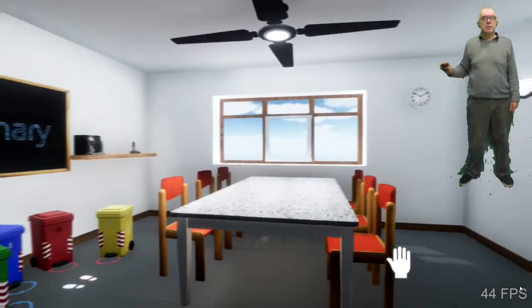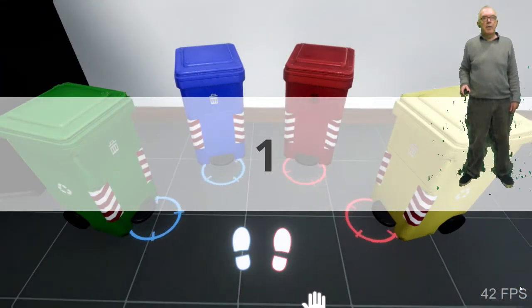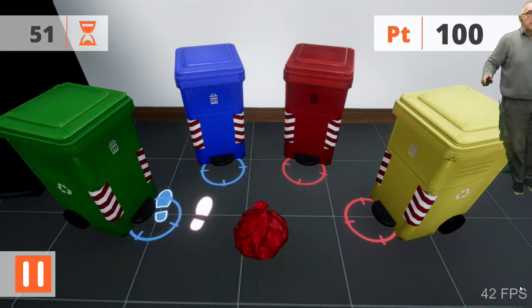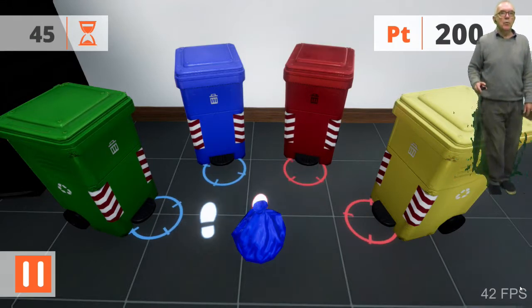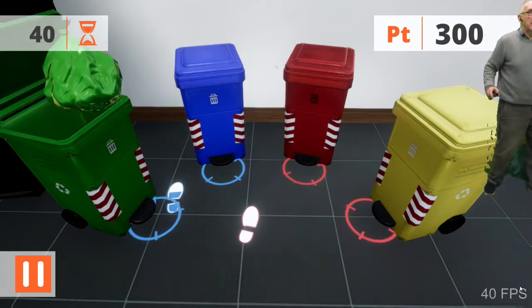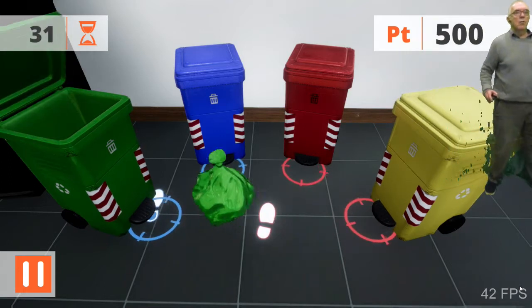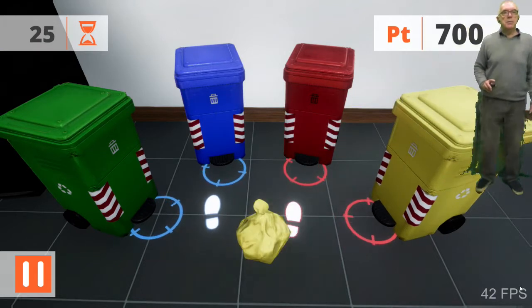This is a different exercise because it involves foot movement. So here are the trash bins, and in a moment I will see a green trash bin. I don't want to put it into the blue one, I want to put it into the green one. So I move my feet to the correct bin. Blue one into the blue bin, green one into the green bin, yellow one into the yellow bin, and the bins that come up in sequence are random, so that you can't effectively cheat by knowing which bin's going to come next.